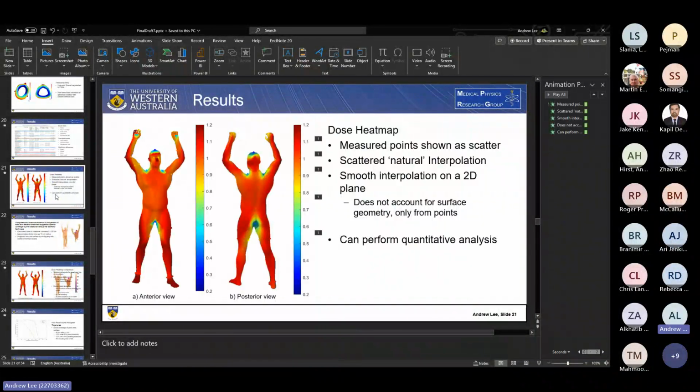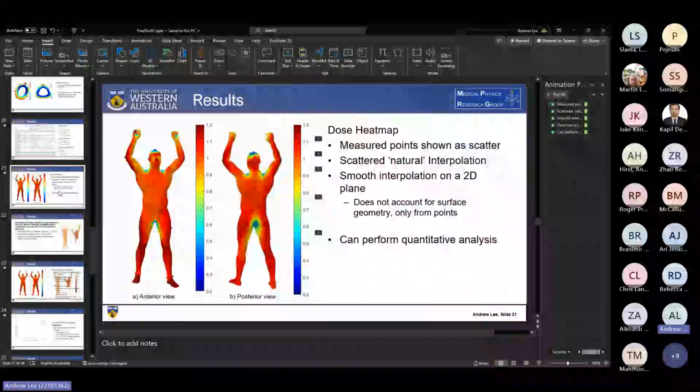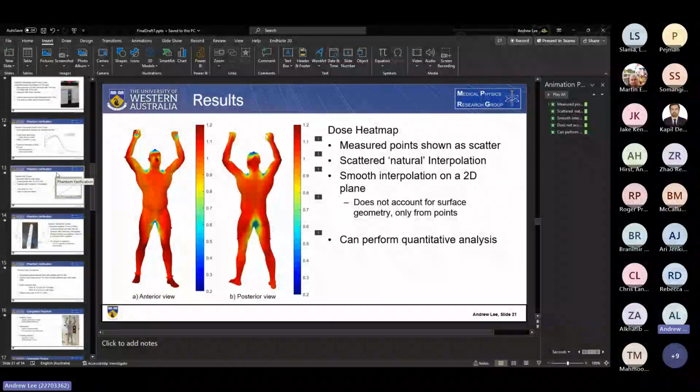Yeah, so a lot of time can be saved in properly setting up the printers and establishing those, for example. But in general, it would potentially be an important factor to consider the reusability of a phantom. So for something like this, especially since we're looking at surface doses only, it would be interesting to consider an internal frame and then patient-specific attachments for, say, a wider stomach or a smaller stomach. And that would save time in the future of having to reprint phantoms. So I think in the long term, that would be ideal. In terms of settings, it's just the standard 3D printing settings in terms of maximizing your volumetric flow by increasing your nozzle size.